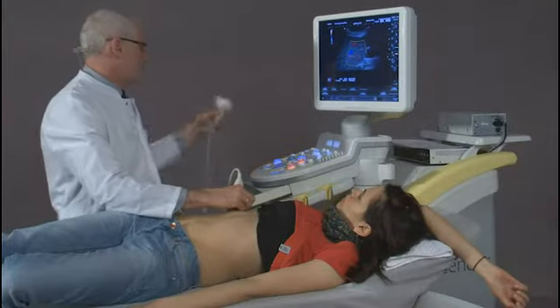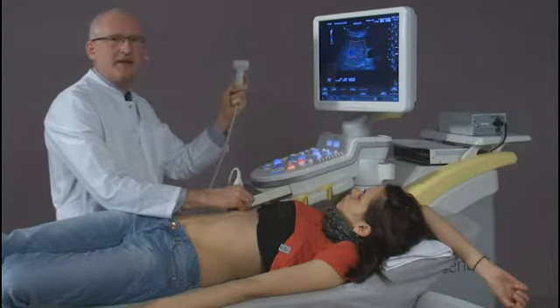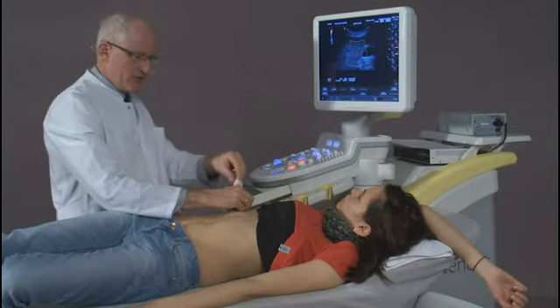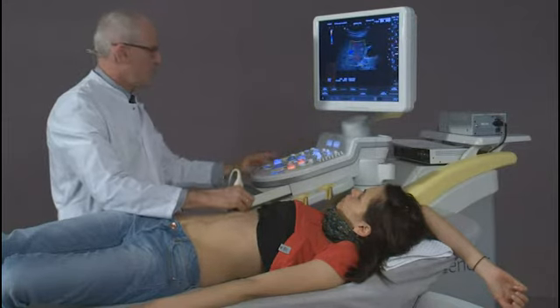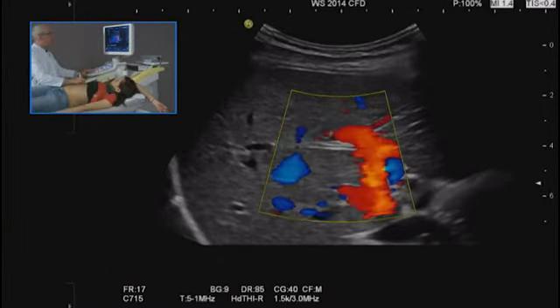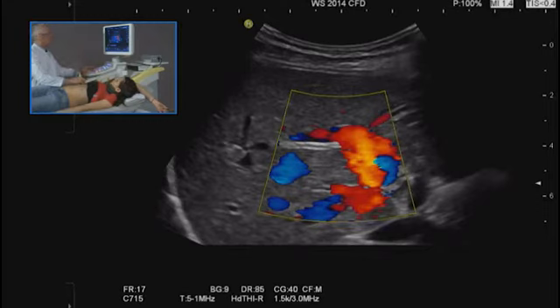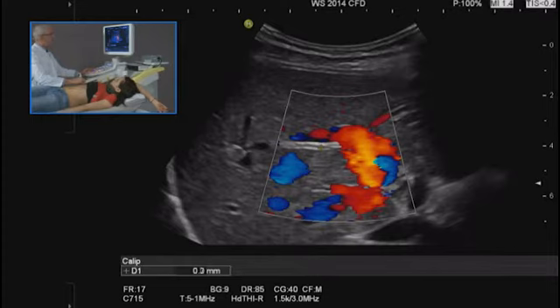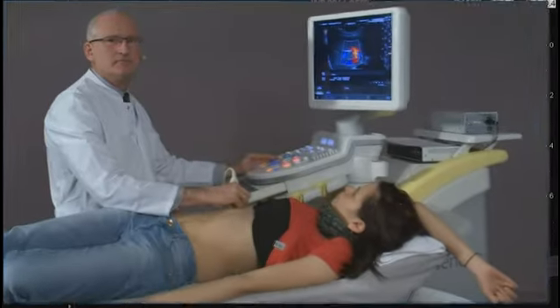The evaluation of the intrahepatic bile ducts is best performed with a high-frequency transducer, but also with a transabdominal transducer, curved array. Take a breath, and using color Doppler imaging, the intrahepatic bile ducts can be displayed, as shown next to the marker and the arrow.